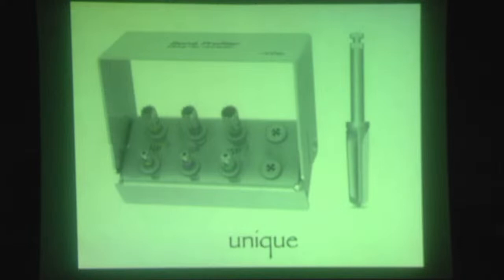conditions the surrounding surfaces. And this is the final drill that you can find in every Dentsply Sirona MIS implant set. And if you use it as a final drill, then you have the chance to collect so much autogenous bone as fresh as it could be.